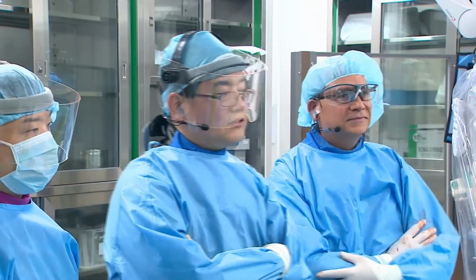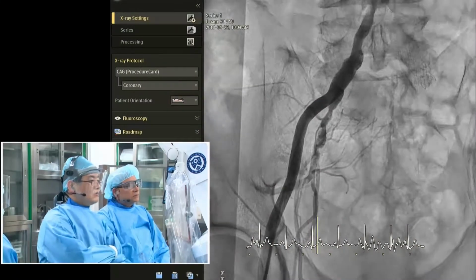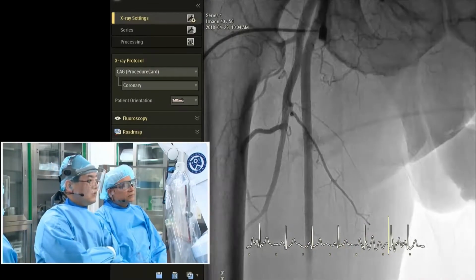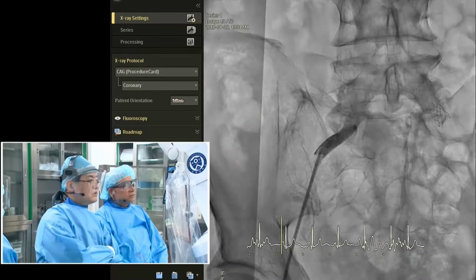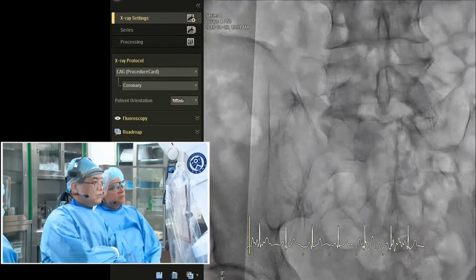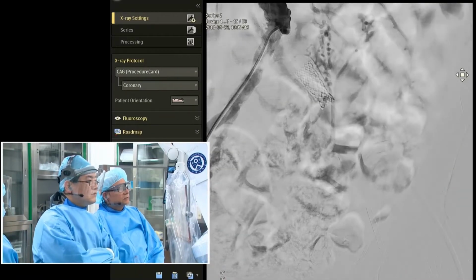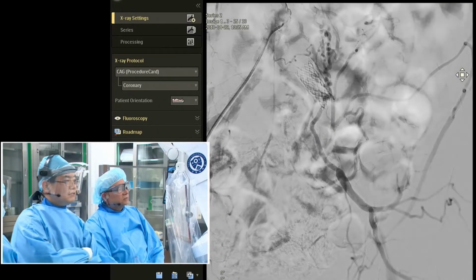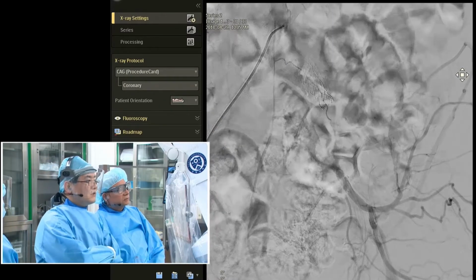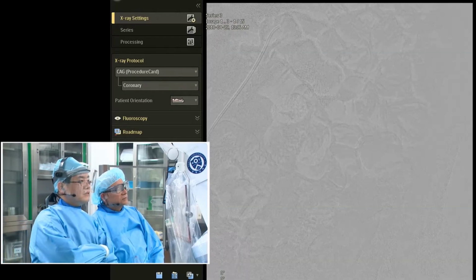Okay. So this is where we started. Right side angiograms first. We performed the right side puncture, the puncture side was okay, and the right common iliac had a little diseased portion, but the pressure was not bad. So next slide. So this is the initial angiogram from contralateral. There is a stump at the left common iliac ostium, but the total occlusion was noted. So next slide.